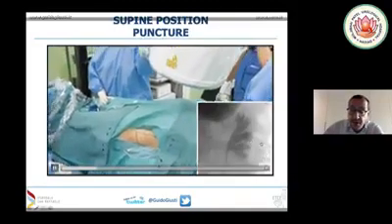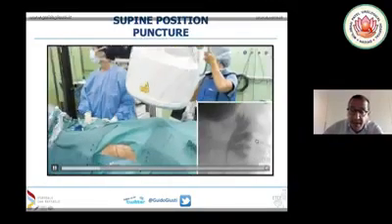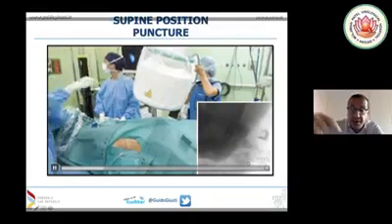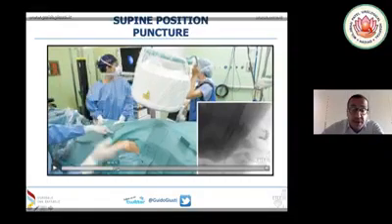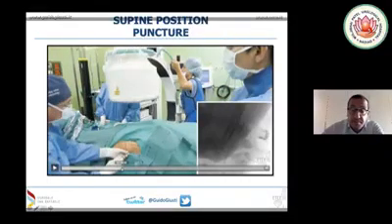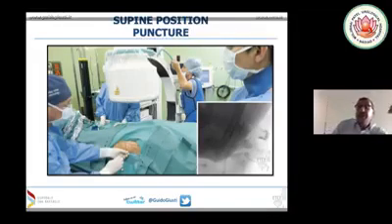You see, and by doing this, you will see that my needle is clearly very, very below. So my puncture was too much anterior. So that's why I ask my nurse to go back. I retrieve my needle and I incline the needle down. Unfortunately, maybe because the video is too heavy, it's not running. But anyway, it was just to show you the triangulation.